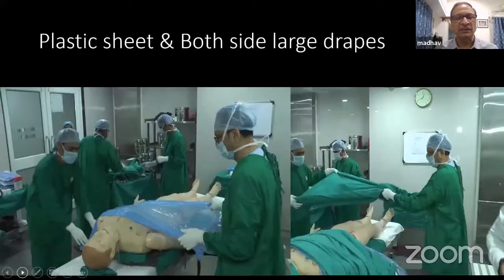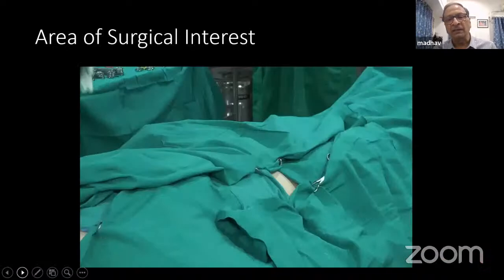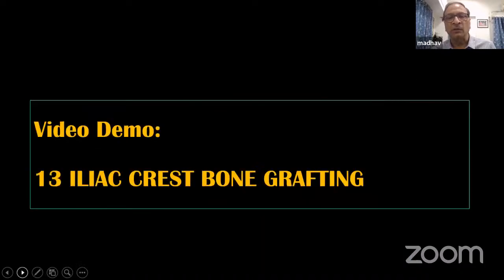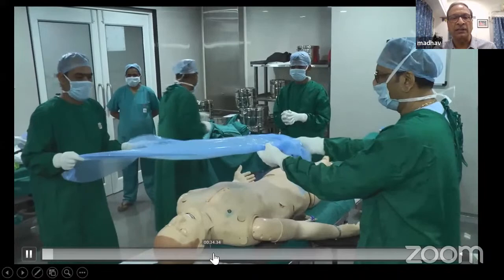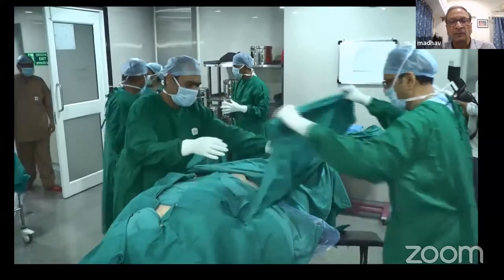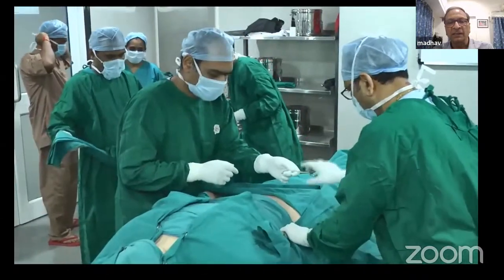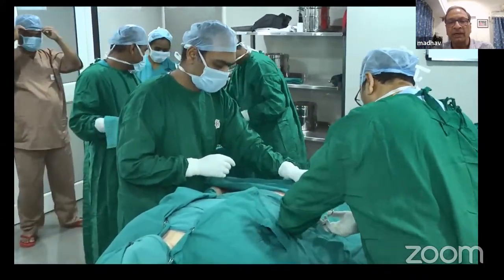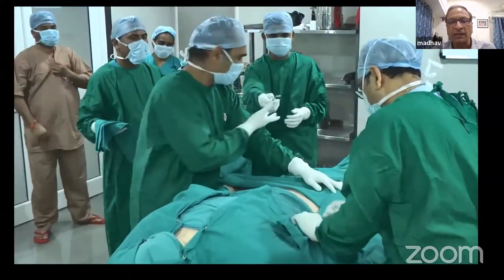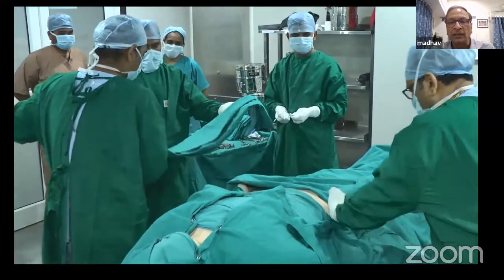So again, the patient is in the same supine position, anesthetized, scrubbed and prepared. One plastic sheet goes above, one below, and then similarly, just a small rectangular area of the iliac crest from where you need to take the graft. So this is the video. So you isolate the iliac crest from all the 4 sides, leaving only a small square or a rectangular area of the iliac crest exposed from where you need to take a graft.